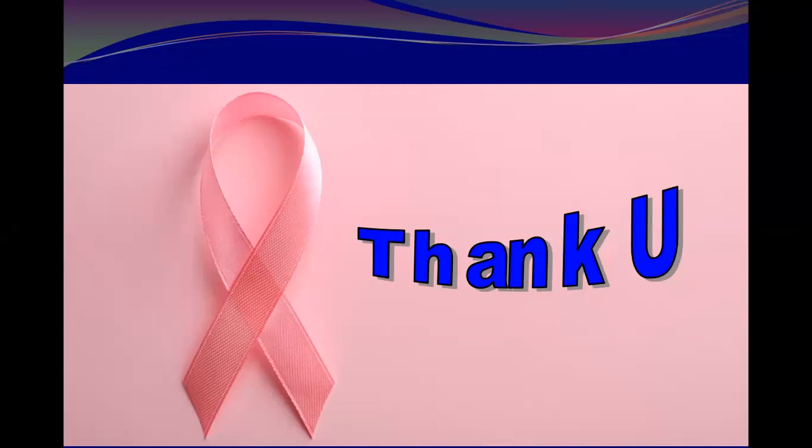Okay, I have shown you elastography also. Yes, elastography can give some help, but she would like to see the gray scale before going for elastography. So if you can use this just to eliminate. Yes, I told her the low frequency and even the convex probe, the convex transducer.